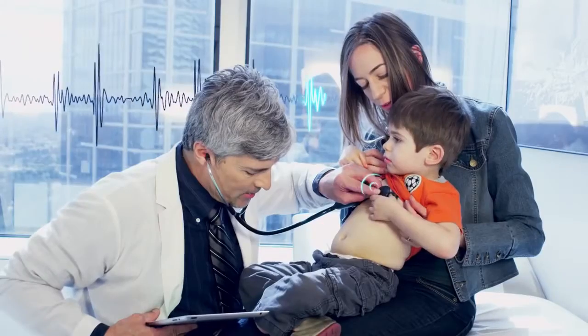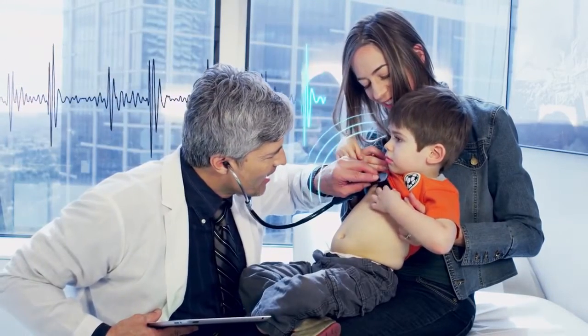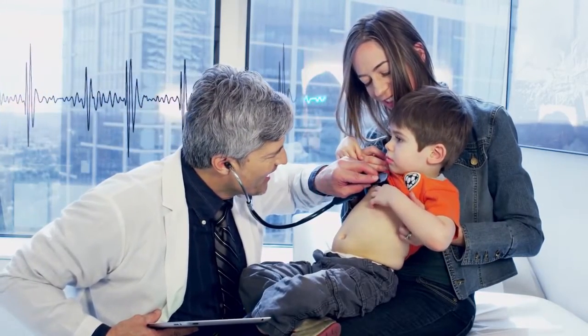Hi everybody, I'm Steve Avala, the head of customer success here at ECHO. And I'm Dr. Steve Pham, an emergency medicine doctor, a telehealth provider, as well as a clinical advisor here at ECHO. Today we're going to walk you through how to use our ECHO telemedicine software. Let's dive in.